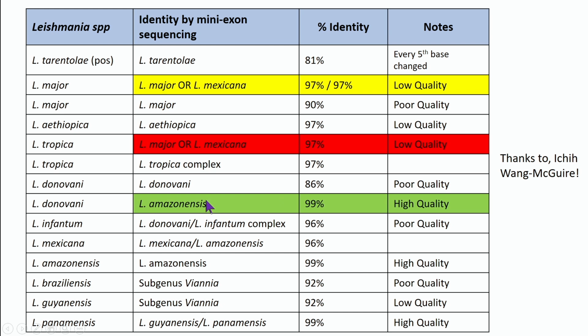So we were working with the Leishmania amazonensis, and we went through the standard lab medicine resident call, right? When could the specimens have been swapped? Chris and I were very careful doing this. I really don't think that we swapped them. We do have other specimens from other points in the culture, and so we'll do some testing of this.